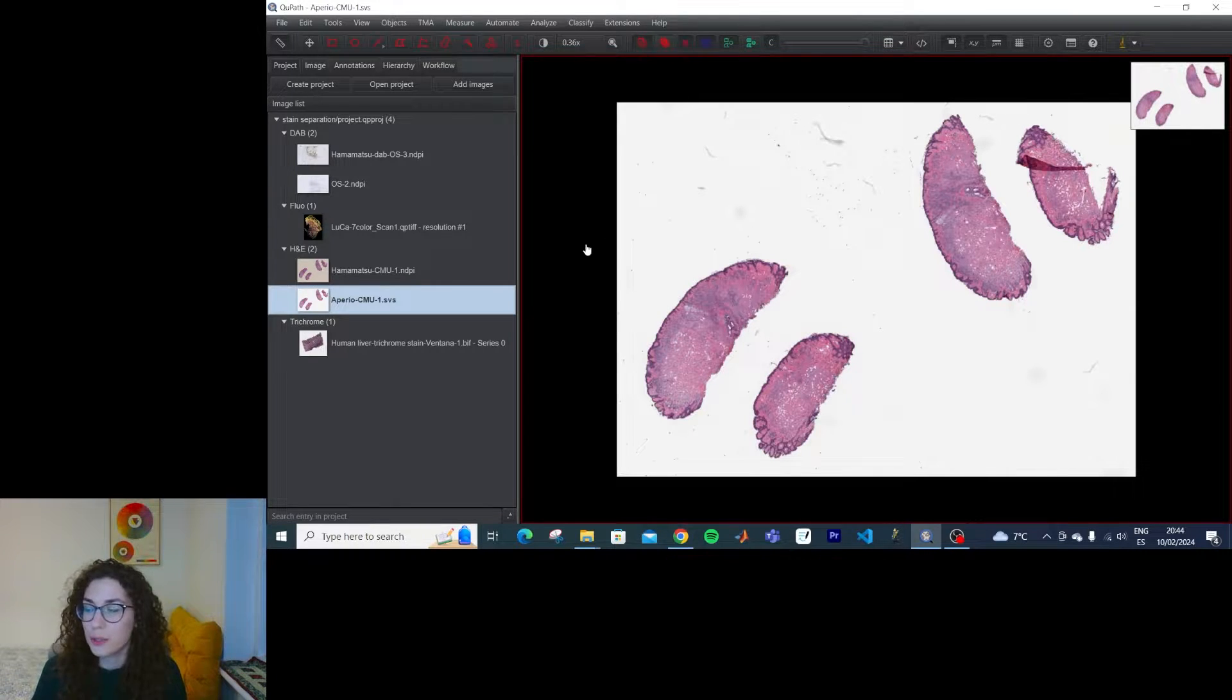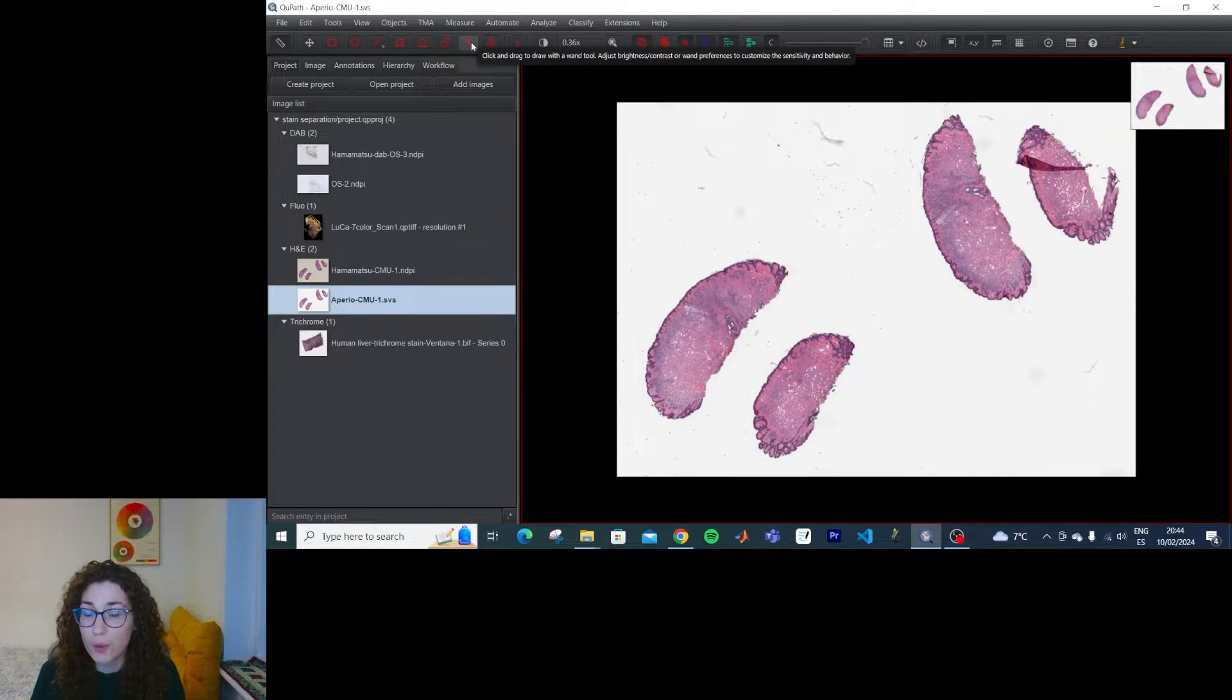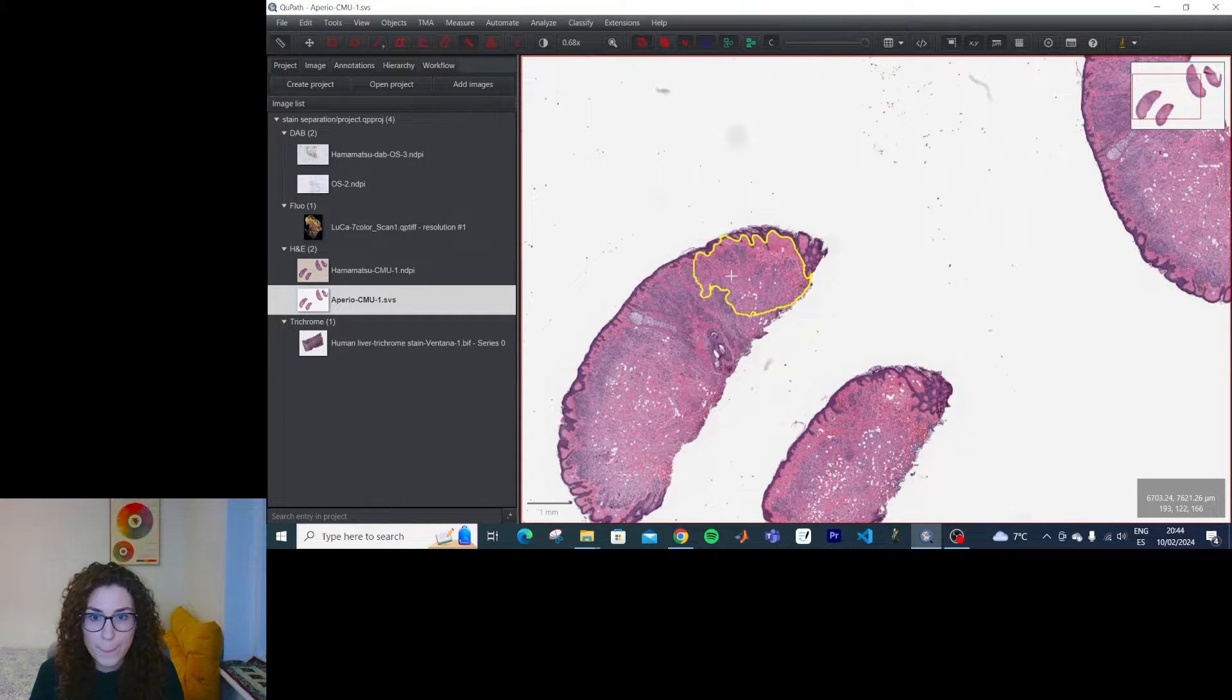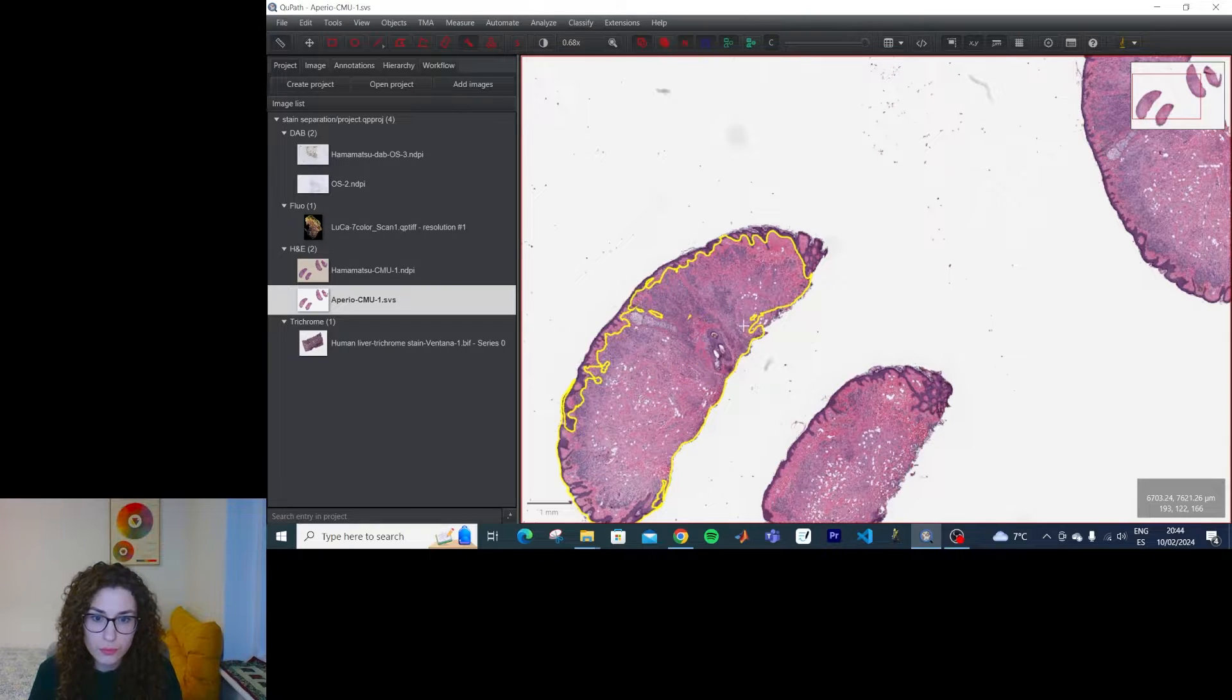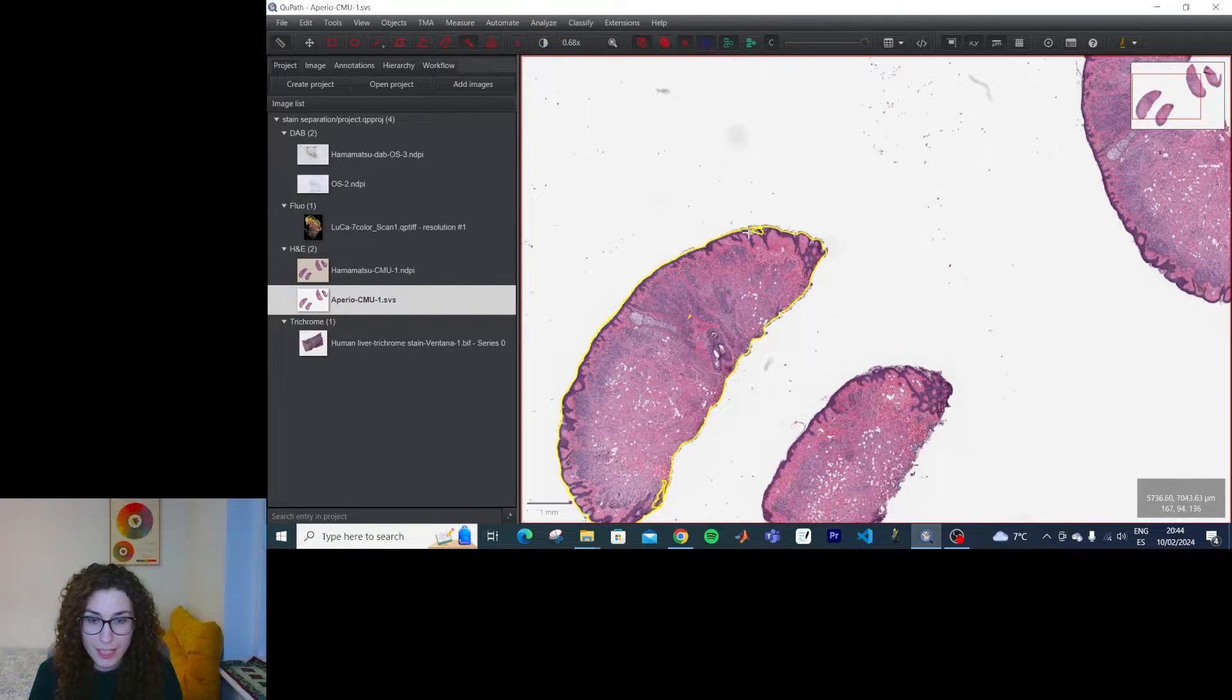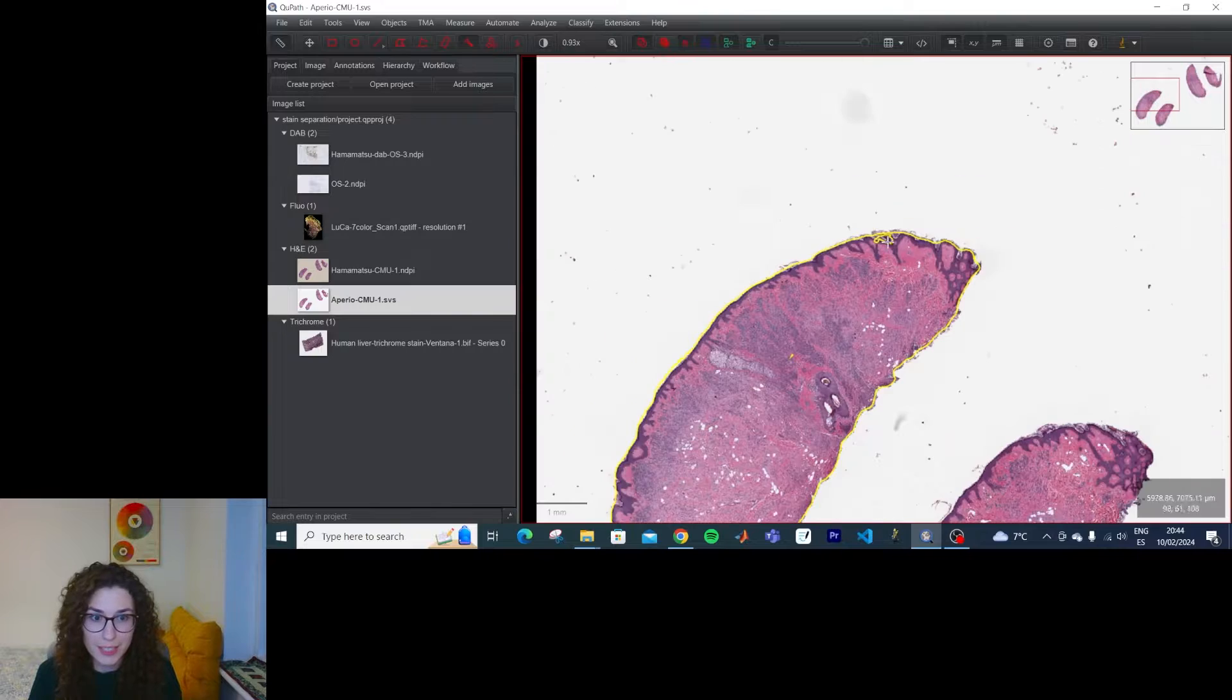Okay, so the first step would be to learn how to do it manually, I think, and for that we could probably use the wand and annotate tissue. Obviously the resolution you're doing this in will affect the level of detail with which you're doing it, as you can see.